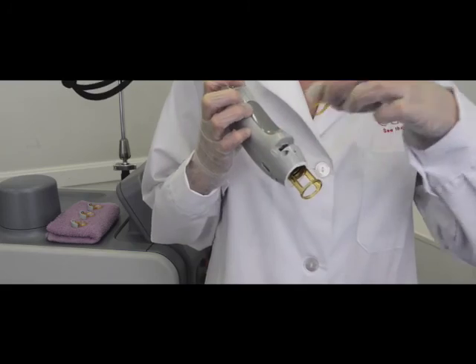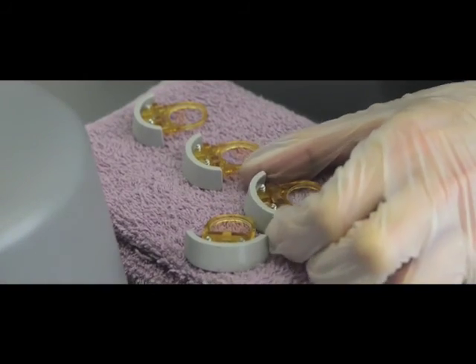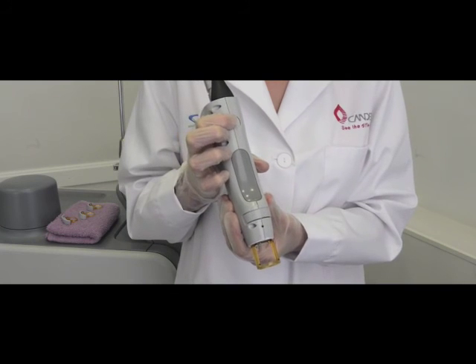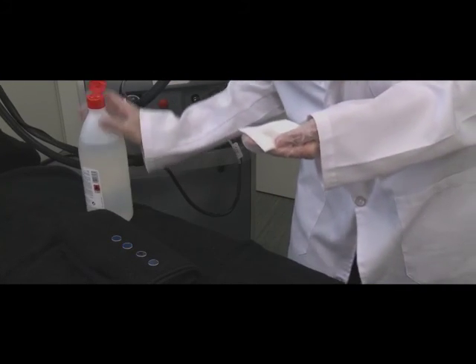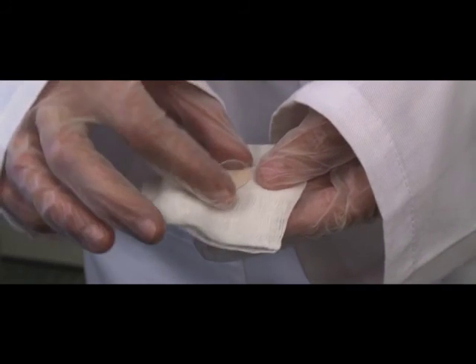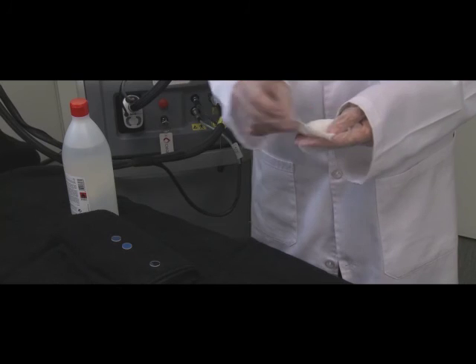During longer hair removal treatments, placing multiple window holders at the ready is useful for rapid changing. At the end of the treatment, all windows can be removed and cleaned at the same time. Windows should be cleaned with isopropyl alcohol and a soft cloth, gauze or lens paper. Be careful not to leave a fingerprint by touching the window with your fingers.